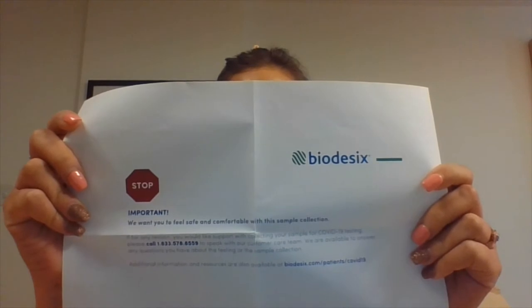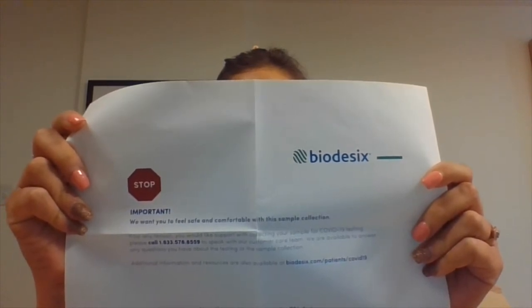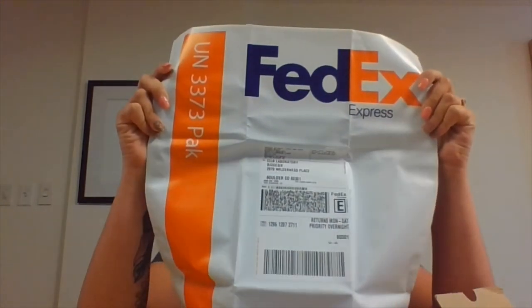You will find a card with a stop sign on it. If you have any questions during this collection of your sample, please stop and call the phone number on the card. We will be very glad to help you. Finally, there is a pre-labeled FedEx return shipment ClinPak. This is what you will use to return your sample to the Biodesics lab.